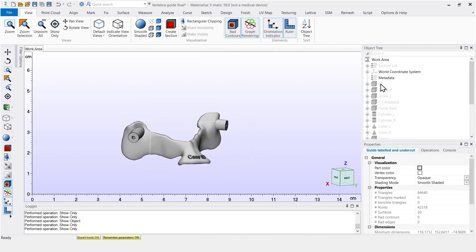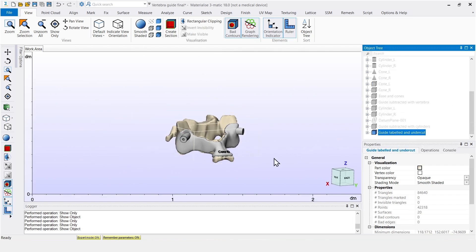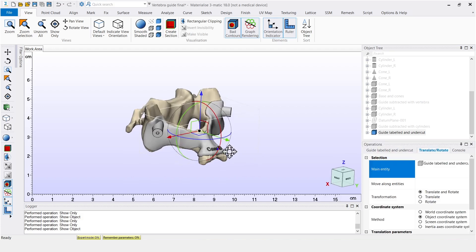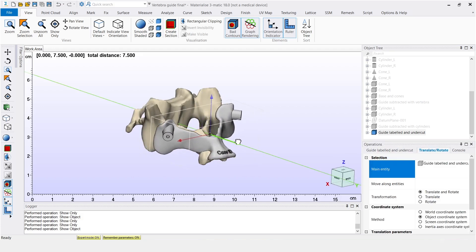Now, in order to ensure proper positioning on the patient's spine, we remove undercuts. Assuming that the guide needs to be placed on the vertebra from the back, like so.